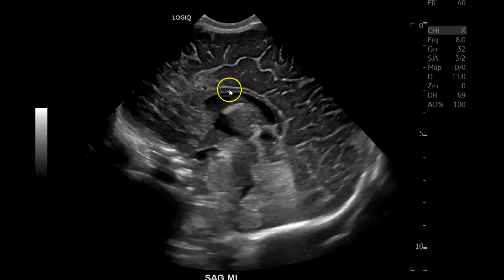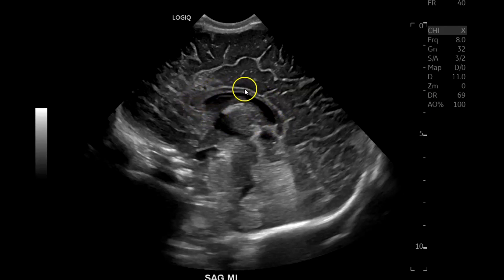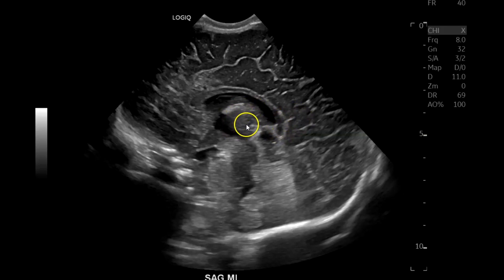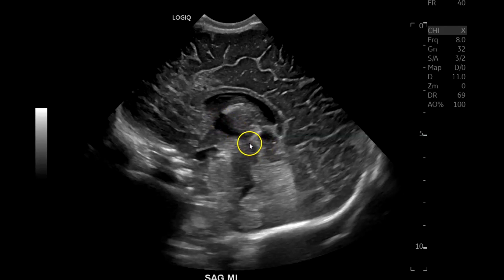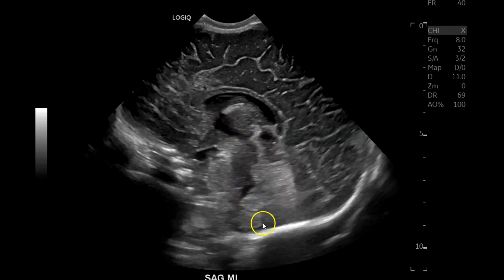Sagittal midline: corpus callosum with the rostrum, genu, body, and splenium — splenium is always in the back. You've got your thalamic adhesion, midline thalamus, third ventricle, cerebral aqueduct or aqueduct of Sylvius, fourth ventricle, and cerebellum.